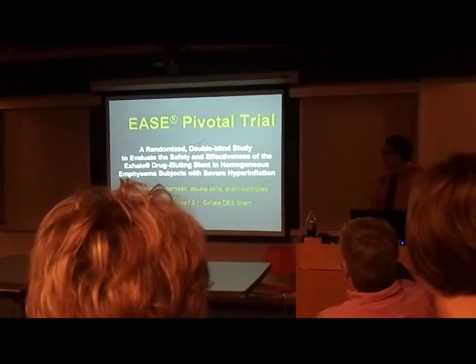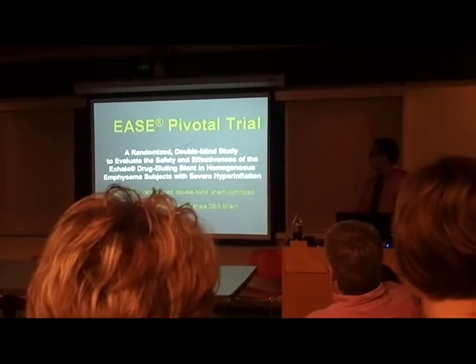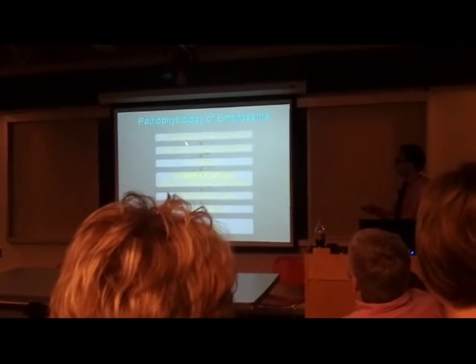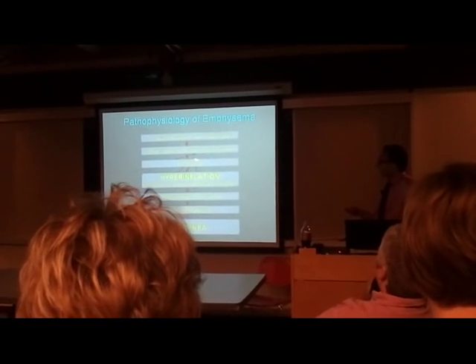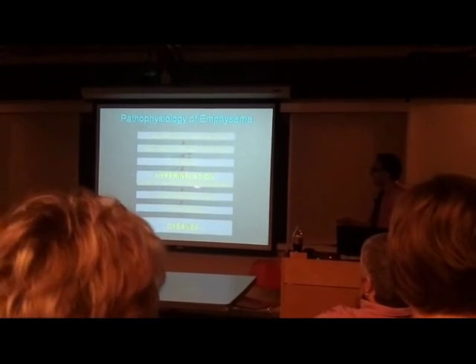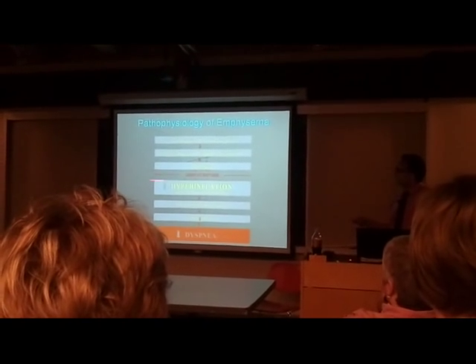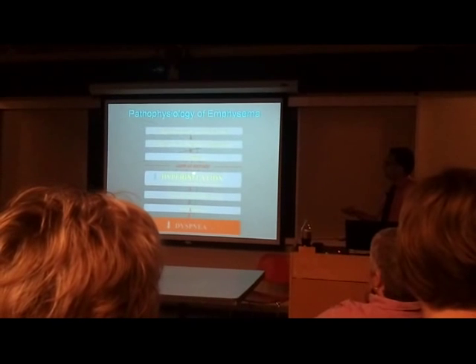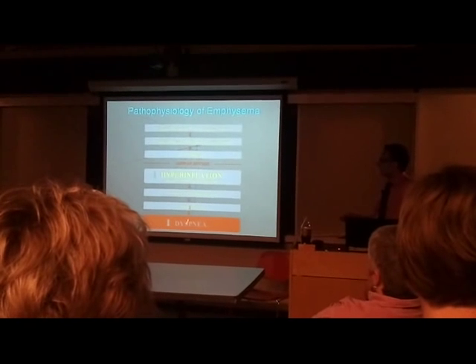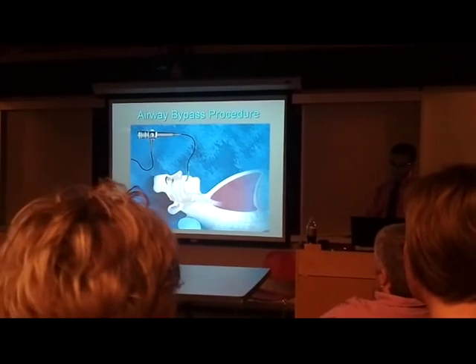Multi-center, done in about 24 centers or so in 13 or 14 different countries. And here was the hypothesis: degenerated tissue destruction, collapse of these small airways, air trapping, hyperinflation, leading to work of breathing, and then eventually leading to dyspnea. And if you somehow can break this cycle of air trapping and hyperinflation by generating an artificial air leak, then you will not have hyperinflation and you will not have all the consequences of that leading to work of breathing and dyspnea.